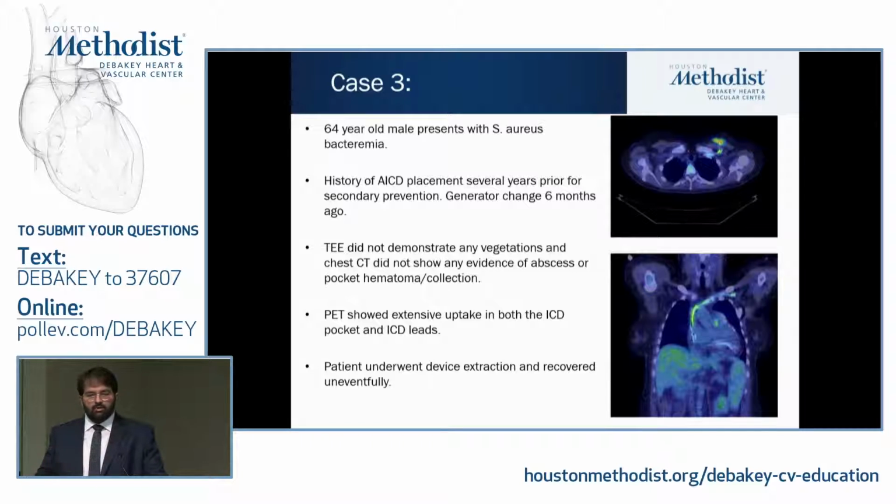As Dr. Kunones touched upon earlier, would this have been any different if he didn't have a PET? But I think it gives us a lot of confidence. We're going through a major procedure, an extraction of an old lead and a dual coil lead, which is hard to extract. And now we have evidence that we should be doing that. It kind of skews the risk-benefit ratio to benefit.